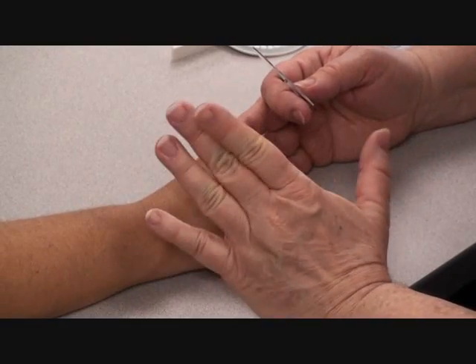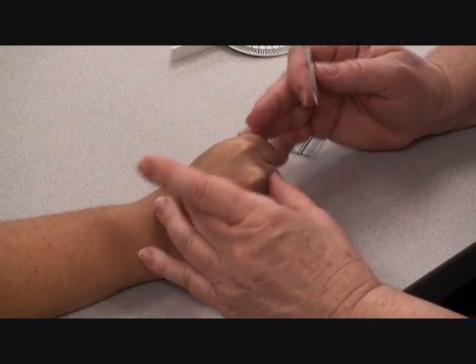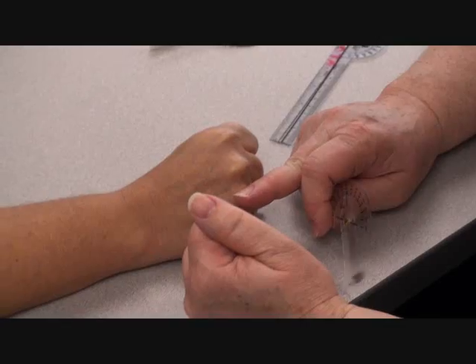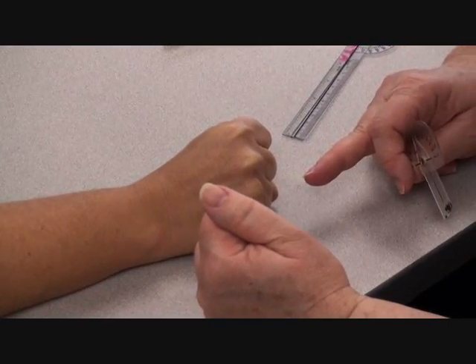But I would record or take note of all my extensions first. And then if I were measuring all four digits, I would measure all the way across and measure all of my MPs and record those and then measure all my IPs and then measure all my DPs.